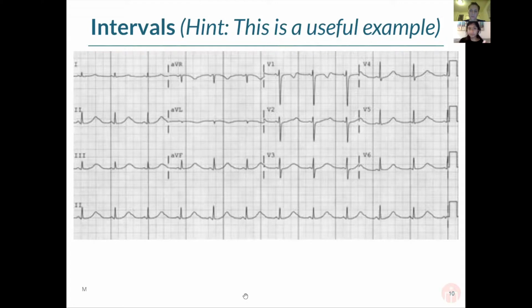However, you'll never be asked to do this for step one, but it's good for you to know in terms of a wide complex tachycardia versus a narrow complex tachycardia. You'll learn all about that when you do ACLS training. But that's another criteria that you should be thinking about when you're looking at broader intervals.